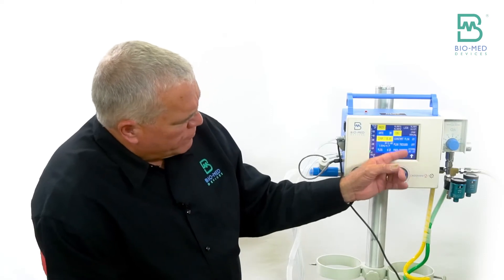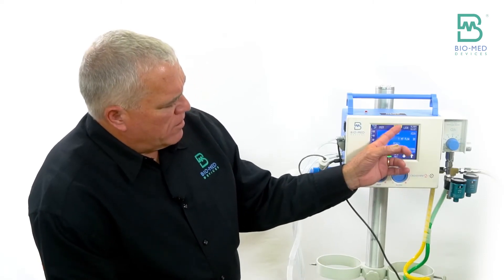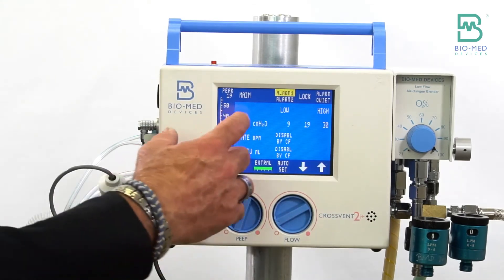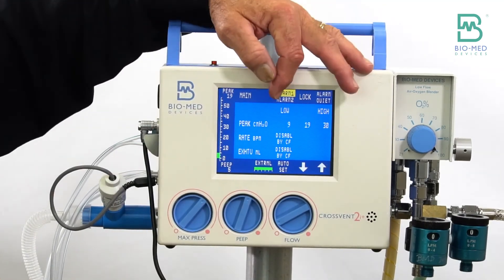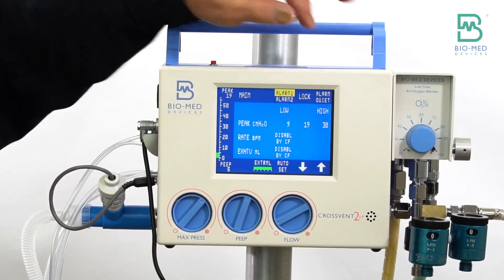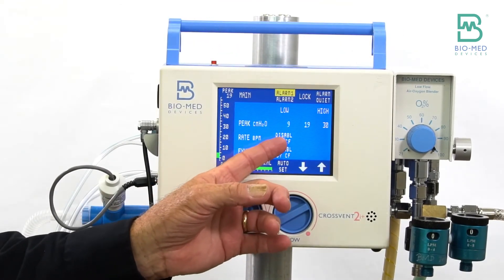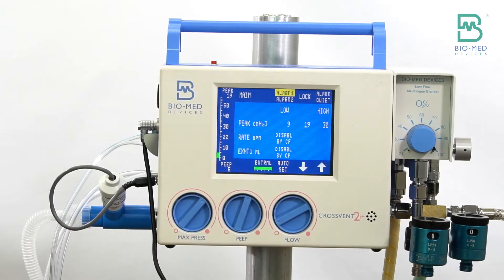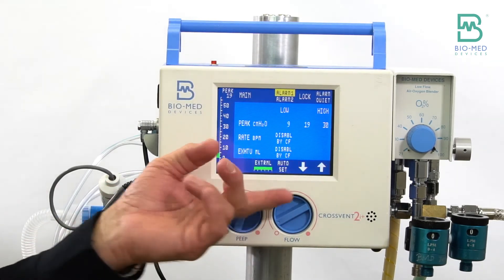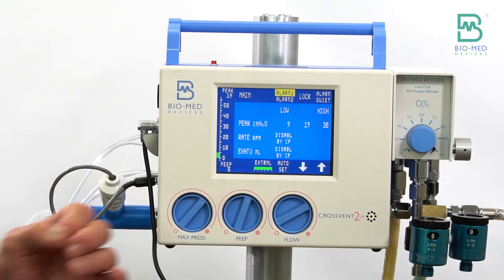When you're in constant flow, if you look at alarm screen one, the only alarm available is peak pressure — high and low alarm. The rate alarm is disabled because you're in constant flow. The exhale tidal volume is also disabled because you're in constant flow and you don't have the flow sensor in line.